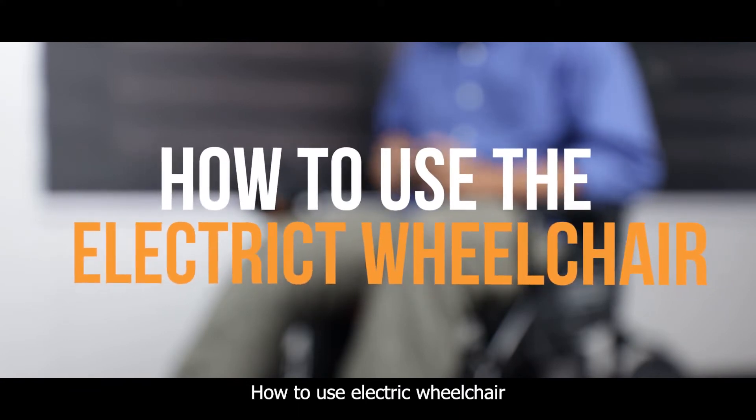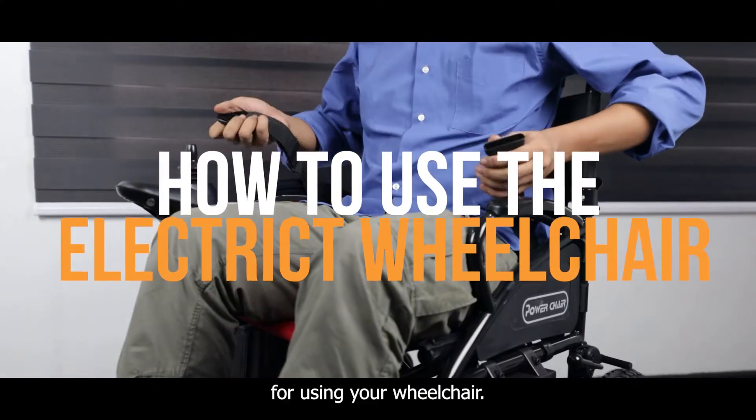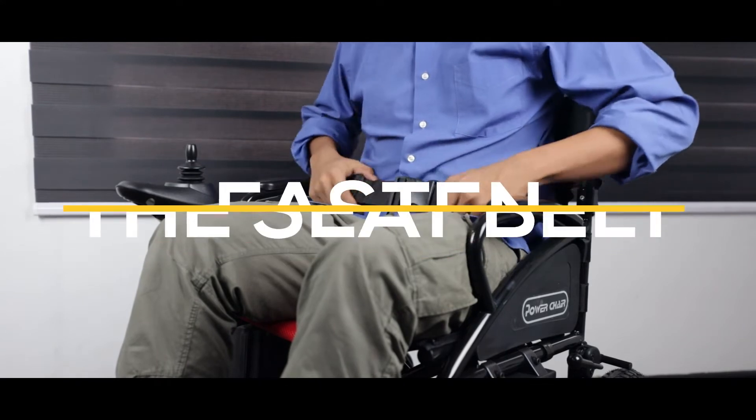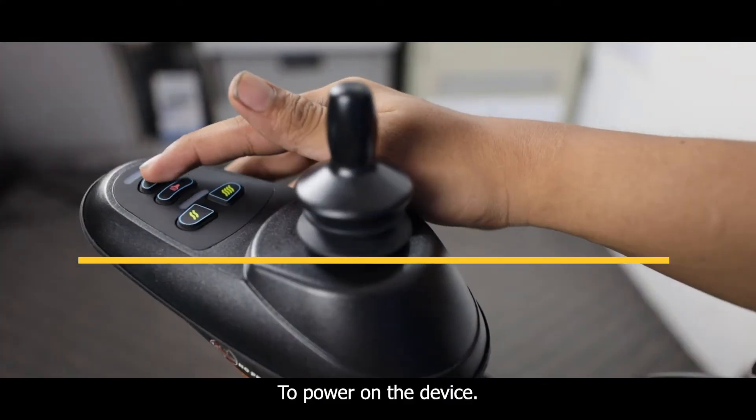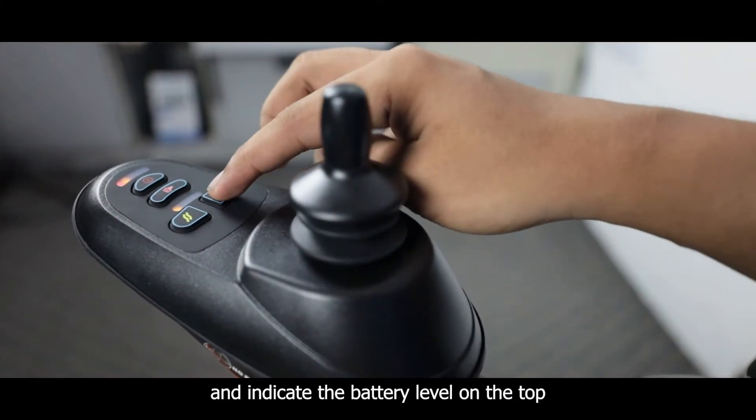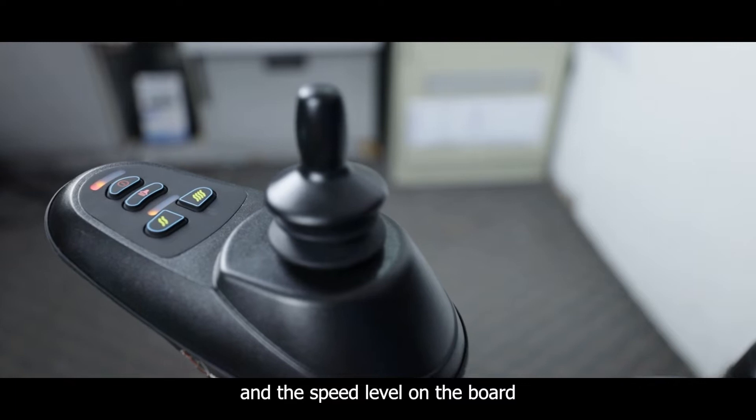How to use the electric wheelchair? Before using your wheelchair, make sure your seatbelt is fastened. To power on the device, press the power button. The device will beep and indicate the battery level on the top and the speed level on the bottom.